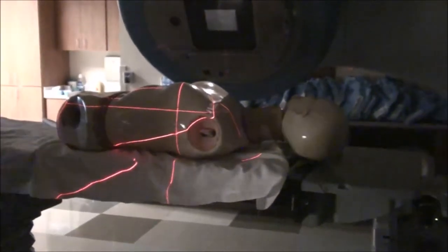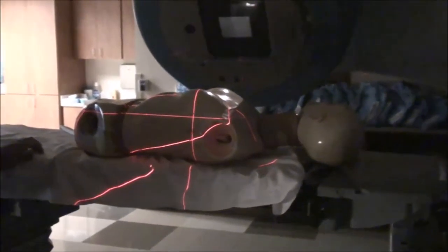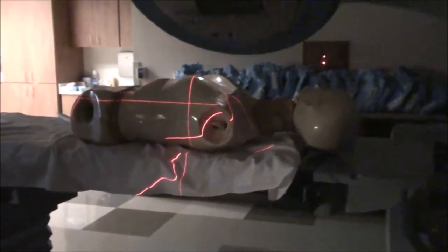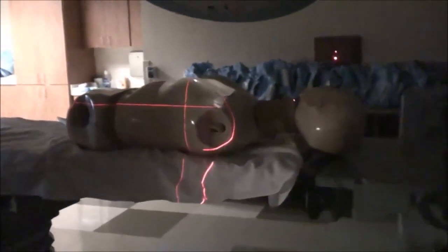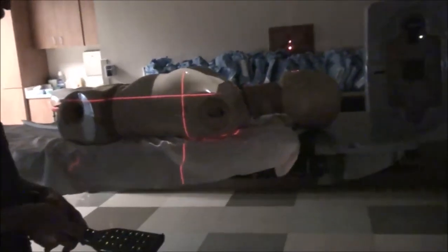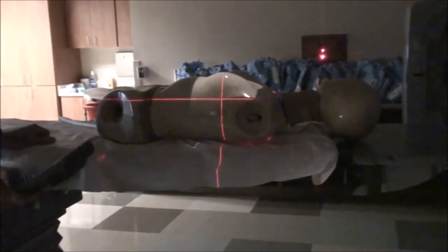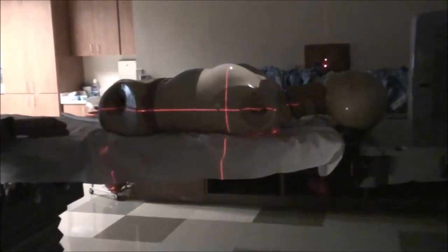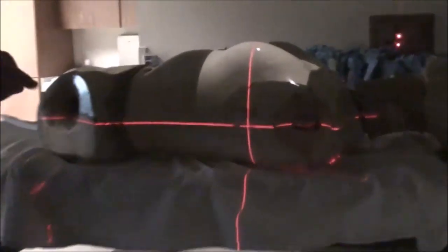The last thing you want to do on one of these, if you want a three-point setup: move the table back and kick the table back to zero. Raise your table until your laser is on your lateral mark, and give yourself a mark on the opposing side. Now you've got a three-point setup. And there's your wire — the laser falling right along with it.